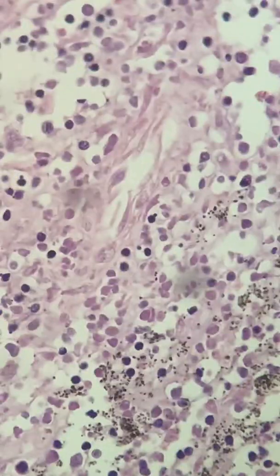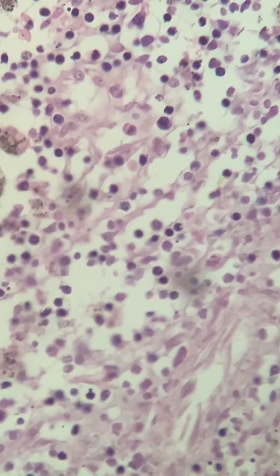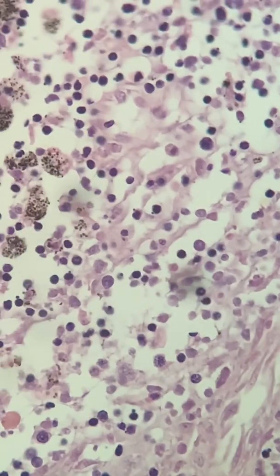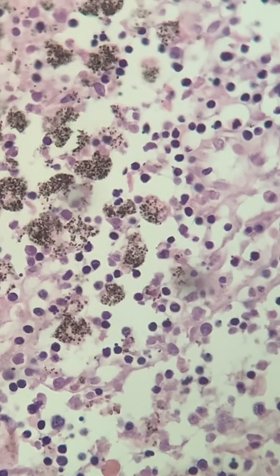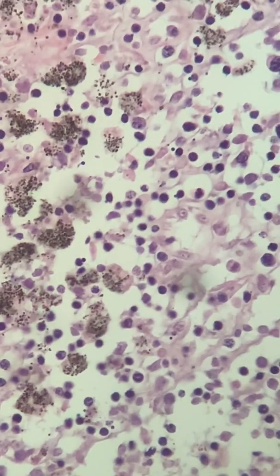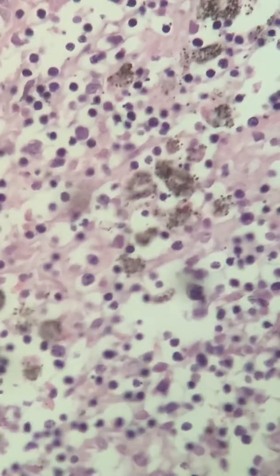Thank you for listening to the video. I hope you learned something. But always remember that the pathology holds the scientific key to evidence of disease, its origin, its development, and disease manifestation. Thanks again. That's some nice, beautiful pigmented cells here in a hilar lymph node. Okay? Thank you for listening.